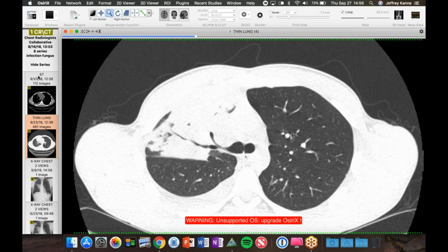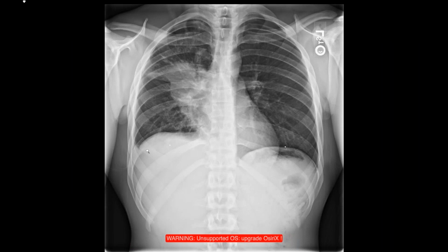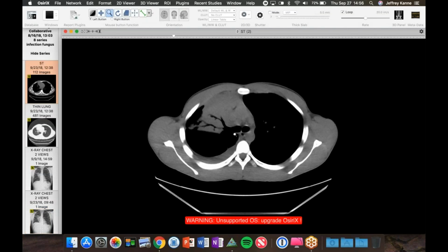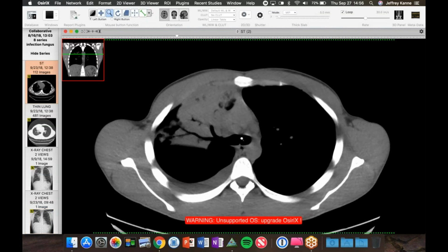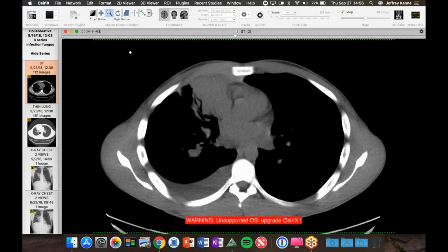There's often airway-centered nodules in the vicinity, and pleural effusion is an uncommon finding, and when it's present, it's usually pretty small, as in this case. If you go back to the radiograph, it wasn't particularly that large. And usually with a bacterial pneumonia that's been brewing for 4 or 5 weeks, you typically start seeing some serious pleural effusion. And then unlike the other endemic fungi, lymphadenopathy is very uncommon. We do see it sometimes, but he's got some mild lymph node enlargement, but it's not the stuff you see with histo that's 3 times the size of normal.